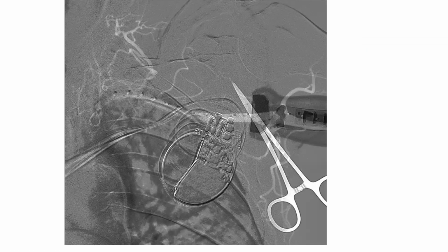Then I stick under direct ultrasound guidance. Now, in patients who are very thick, in whom you're not able to get good ultrasound images, then yes, I would use pure fluoro angio guidance to stick. So I would stick aiming for this artery under live fluoro. In those cases, I would also keep a wire in from the radial artery. I wouldn't just use the angio roadmap smart mask image. I would put a wire, and with my needle, I would aim toward that vessel, verified by both the wire and the smart mask imaging.